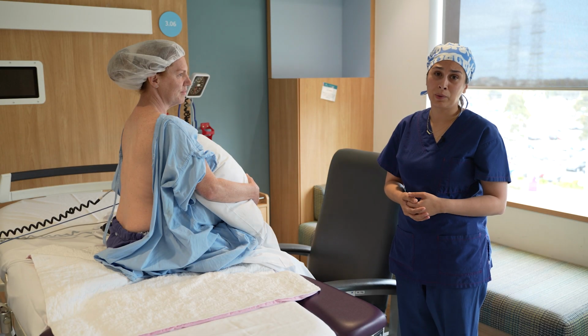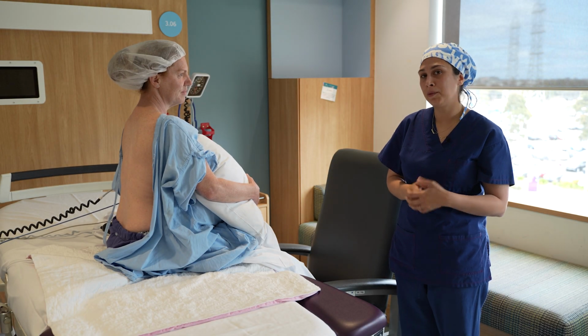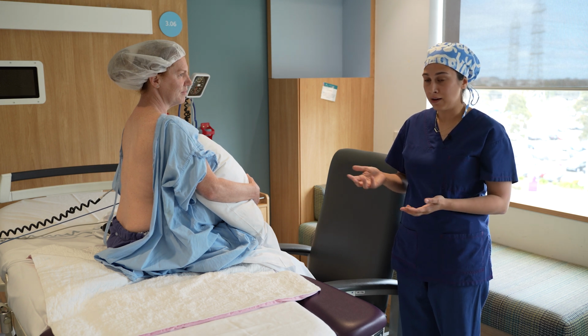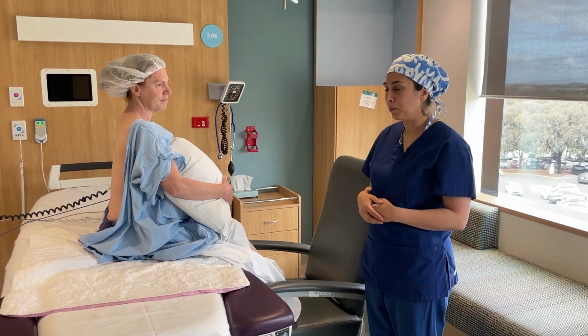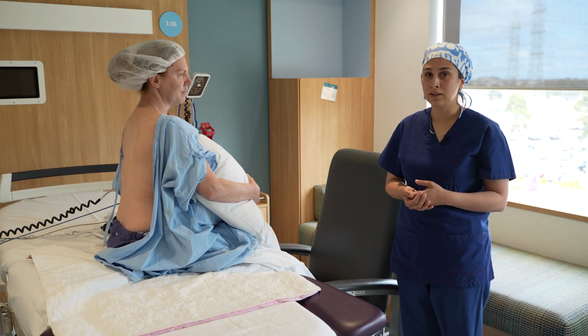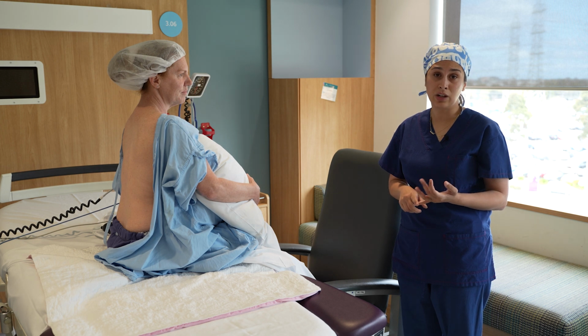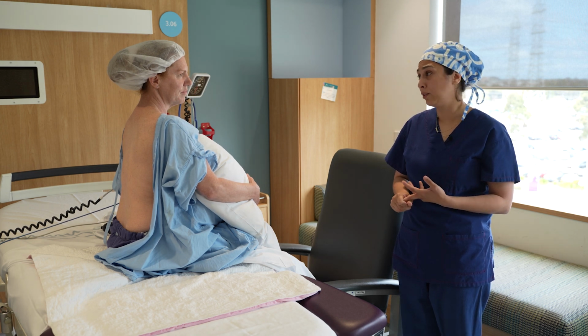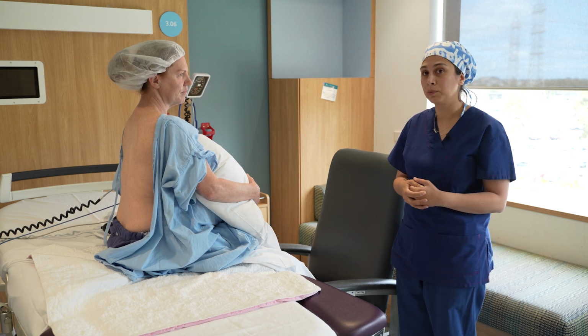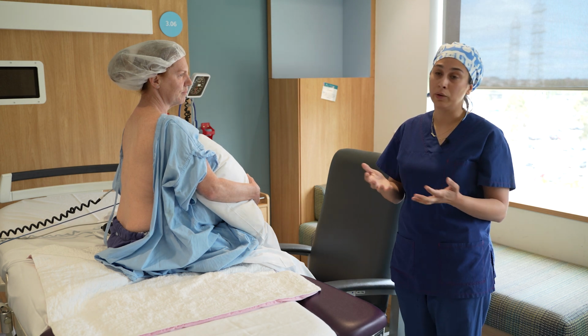We often ask our midwives over the phone during the referral to ensure the patient is ready for positioning. What this ideally means is that they're already in a gown with a drip in that's working well and connected to some fluid, and the monitoring's attached or ready to be attached, which includes CTG, SATs monitoring, as well as a blood pressure ready to be connected for 5-minute blood pressure checks once the epidural is in and loaded.